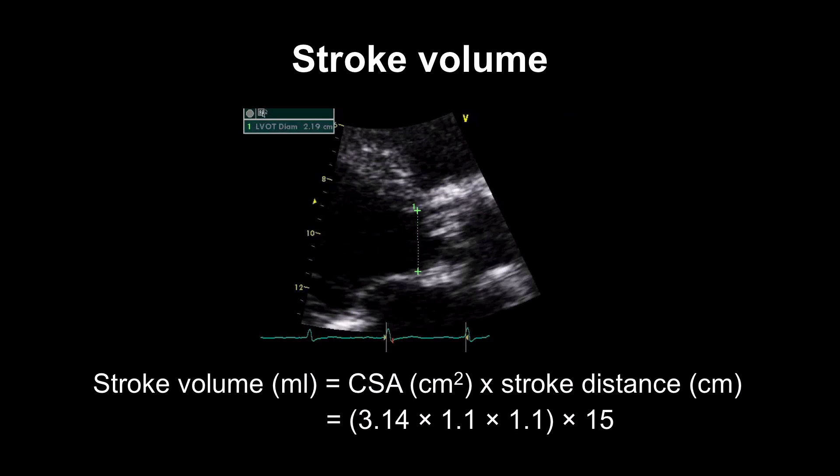And your echo machine will do this for you automatically. So for this case, it's giving us a stroke volume of 57 mils. So normal is about 60 to 100 mils. So this is a sort of borderline measurement.